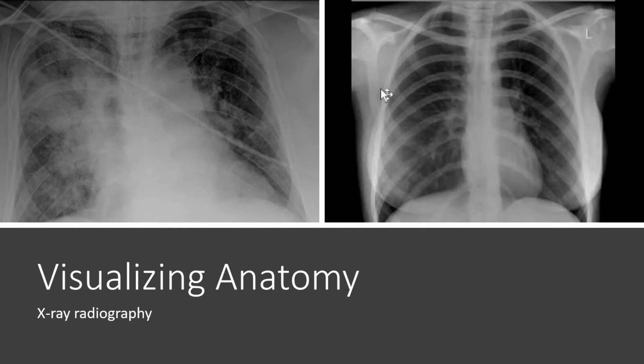In the right-hand picture, you have a clear outline of a heart and the major blood vessels and bronchi and whatever that are in the region that are coming off of it. The trachea and the sternum is fairly dense. The ribs look normal, and the lungs are just big and open and black as night. They are dark. There is nothing in there practically except for air. The actual tissue of your lungs is minimal.